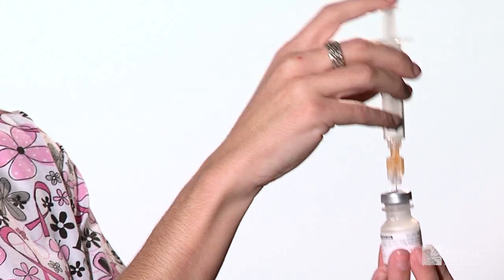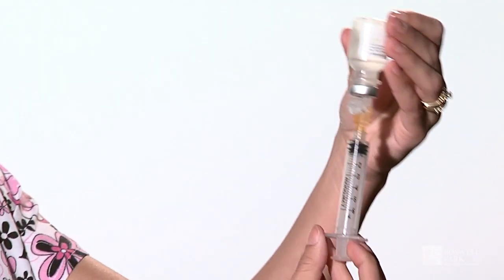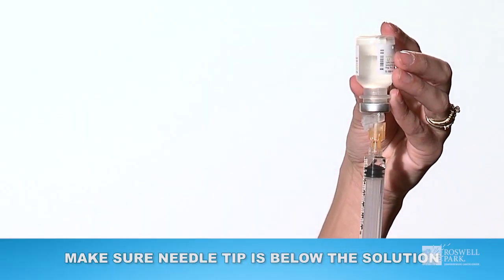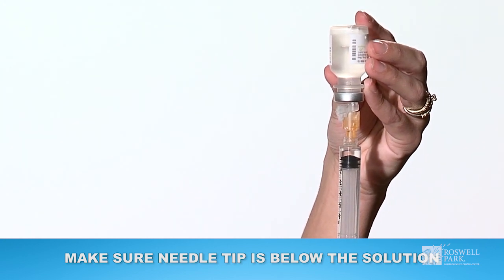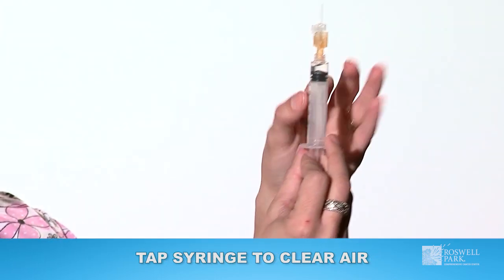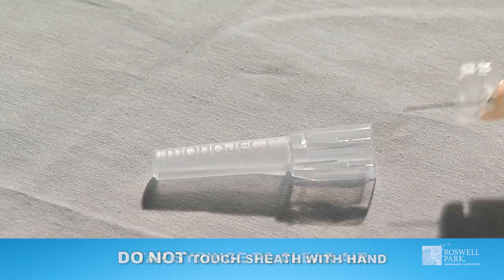Insert the needle into the vial, inject the air, invert the vial, and withdraw the prescribed amount of medication. Make sure to keep the needle tip below the level of the solution while you are withdrawing the medication. Tap the syringe to clear any air from the top of the syringe. Cover the needle with a needle sheath.